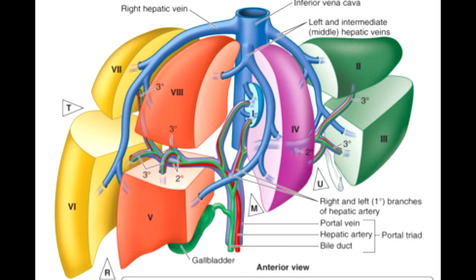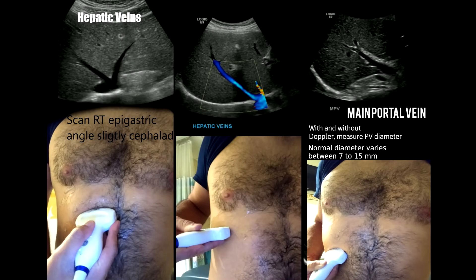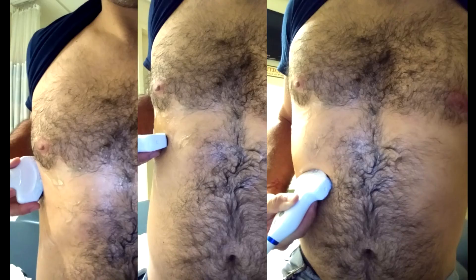One thing to keep in mind is that with ultrasound you're scanning the liver at angles you might not be able to achieve in CT. In CT you get perfect transverse and sagittal images with the patient positioned correctly. In ultrasound you can be angling subcostally, intracostally, or using oblique angles to get better pictures. That's why you'll have several segments in one image, as you'll see in the transverse views.